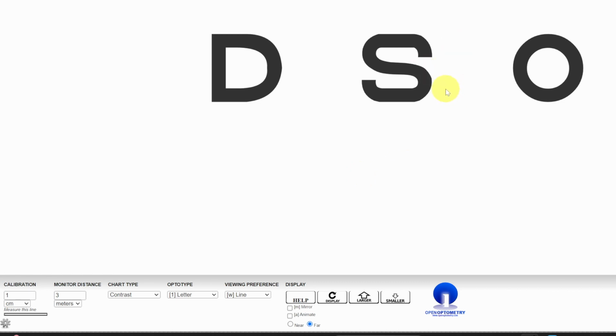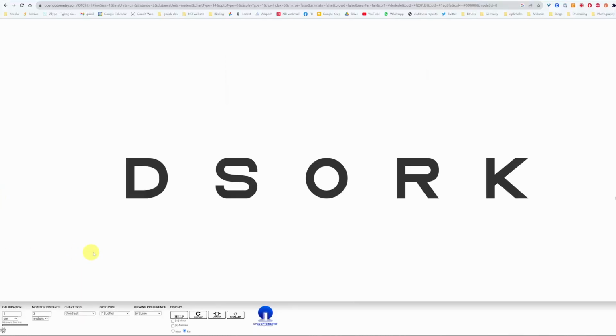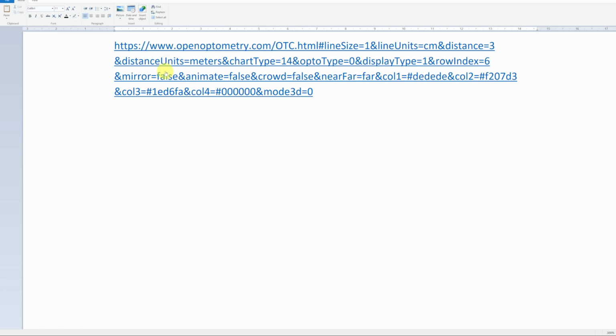But if it's on the Raspberry Pi, the way around that is also relatively simple, because all these settings are set up in the URL over here. Once you've set this up however you want, you'll see it in the URL at the top, which I'm going to show you now. So in the URL, you can see in this top line is a bunch of text. I'm going to copy this, just to show you a bit closer what is going on there. So I've copied that URL just to make it bigger, and you can see in this URL it says units equals centimeters, distance equals 3. So the distance is 3 and the size of the line is 1.